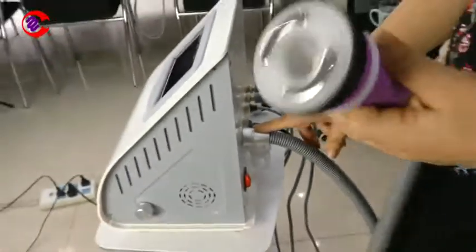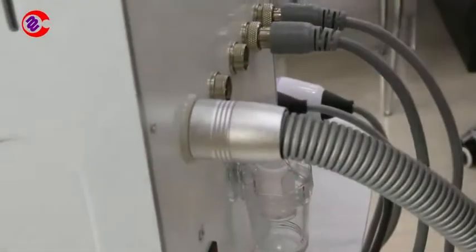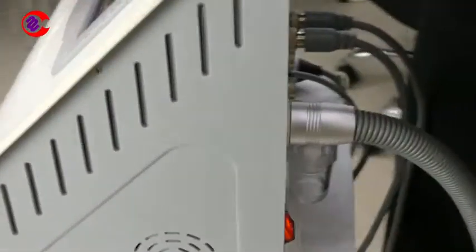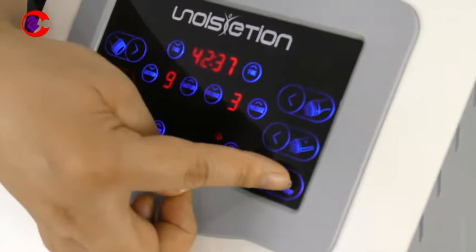Now connect the big connector here, just like this. And then we test it again — set the suction and release, and press start.